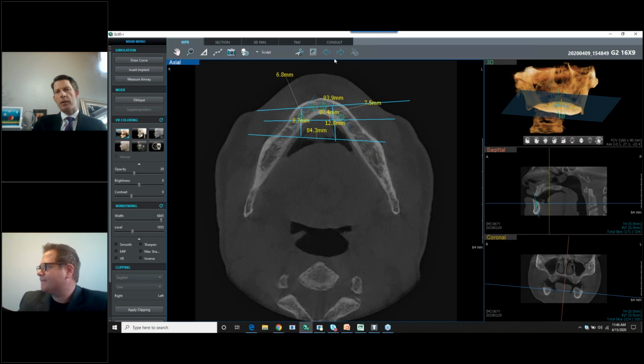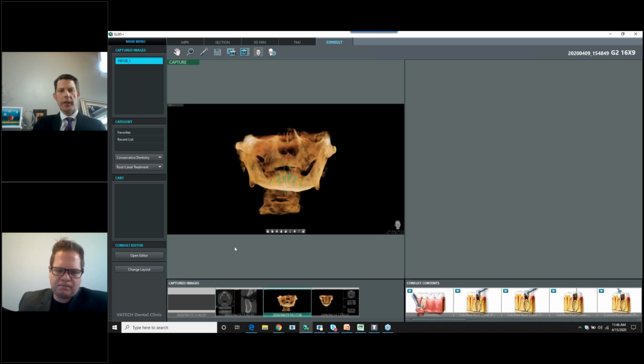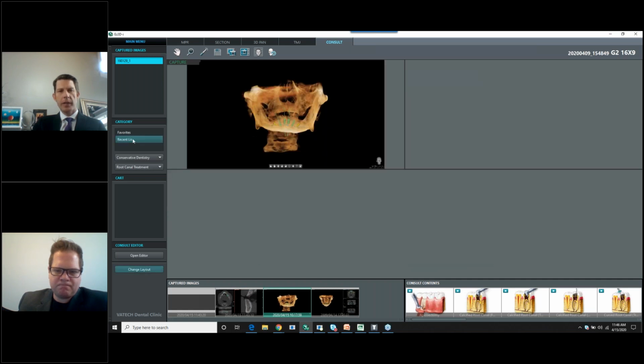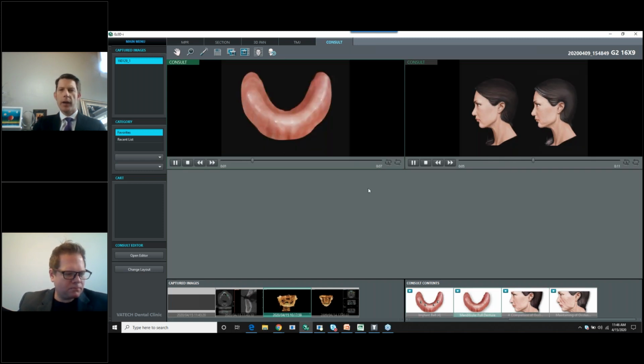Let's talk more about the consultation tool. Have our patient come in. We're showing them our videos, and I'm going to go over here to change layout. I think this is a really powerful tool here because what we can do is we can come over here to our favorites list, and let me scroll across, and we can show our patient our videos. We can talk about the denture that they've been wearing.